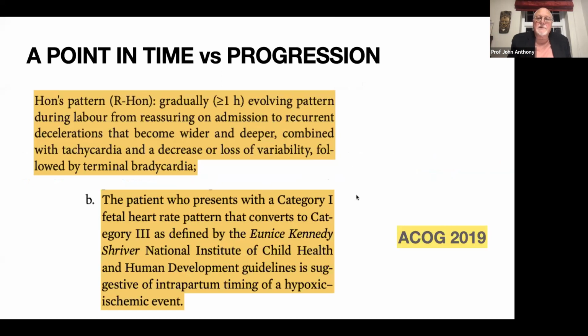Now, I also want to point out to you that there's another thing that's important, also from a legal point of view, and that is that looking at tracings at a point in time is one thing, but looking at the tracings over time is something else. And where there's been a progression from a normal to an abnormal tracing, it's highly suggestive of fetal hypoxia.